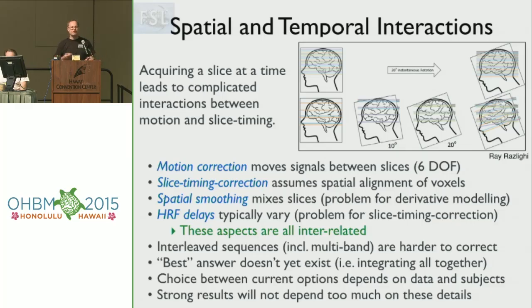So you'll see conflicting opinions. I don't think that there is such a thing as a fixed answer to this question. And ideally, you're in a position where it won't really matter. So good data will actually give you a reasonable result either way. If you're on the cusp, and it really does depend on which order things are going on, that's getting into the non-trustworthy area.